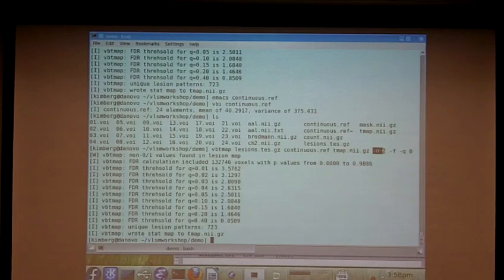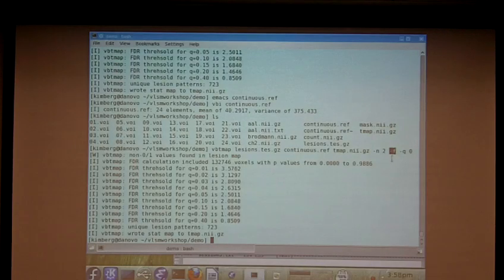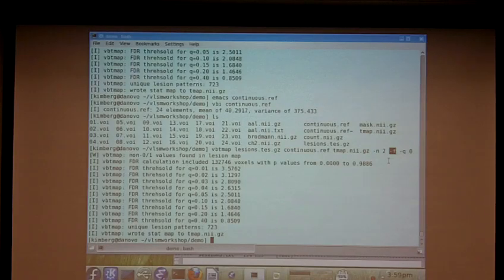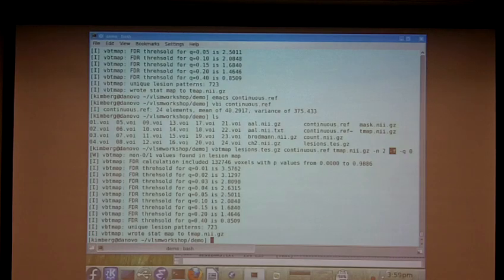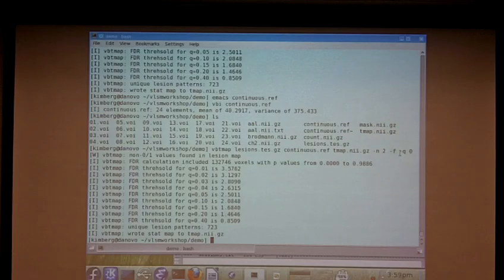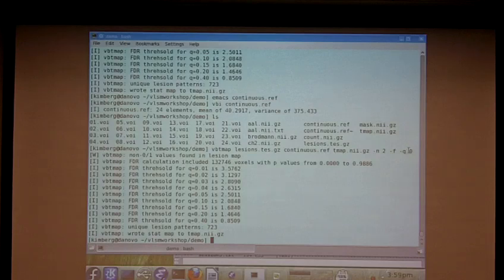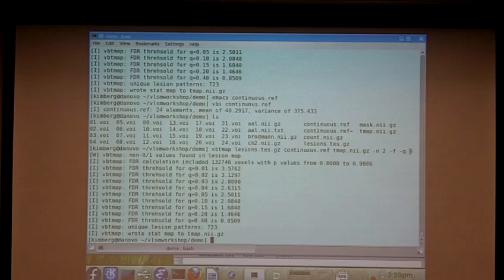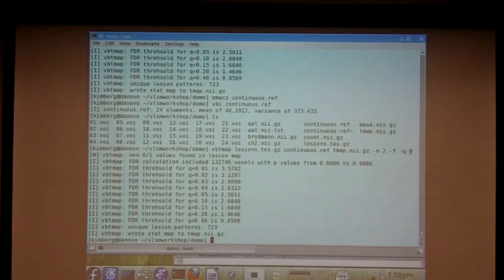So you could get by with just those three arguments, the name of the lesion file, the dependent measure, and your output file. We've done a couple other things here. One is dash N2, which says a minimum number of two lesions. One is using the dash F flag, which means to flip the T values, because I happen to know that this particular dependent measure is set up so that it will have good results when a lesion gives you higher scores. And finally, dash Q0, which means give me an FDR threshold using a Q value of 0. 0 is not actually a valid Q value, but when you say 0, it says, oh, you just want me to give you a few useful Q values. So it gives you a bunch, as you can see down here.